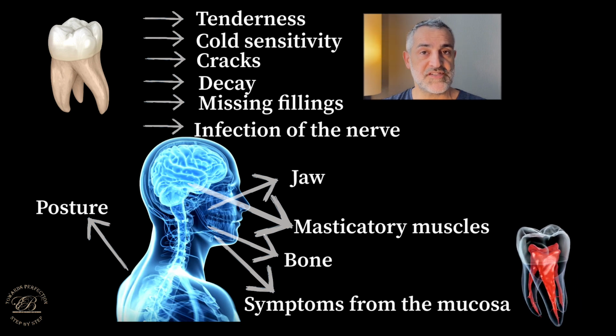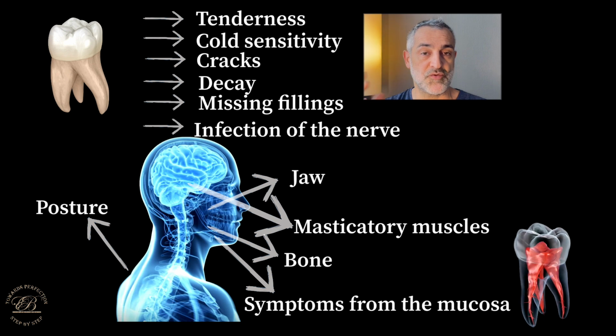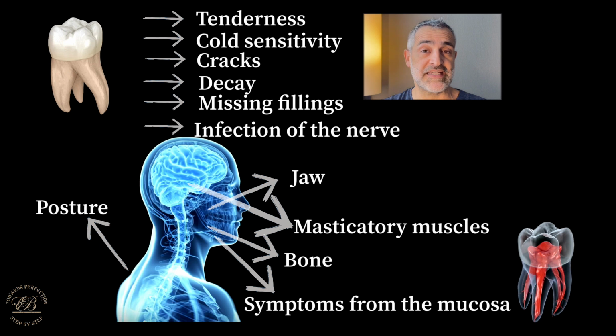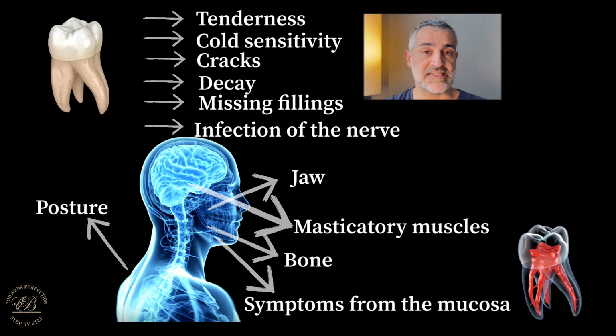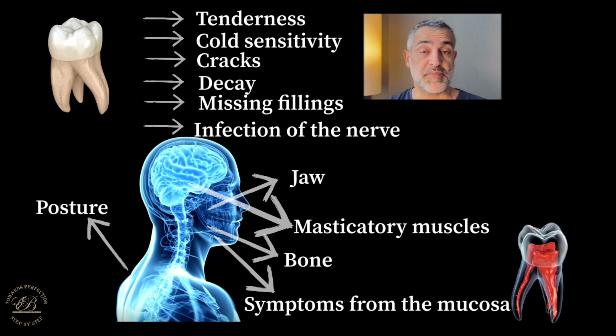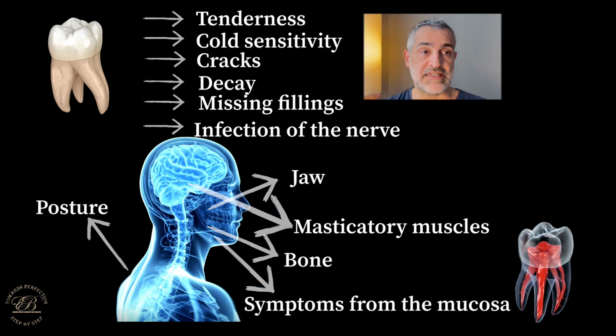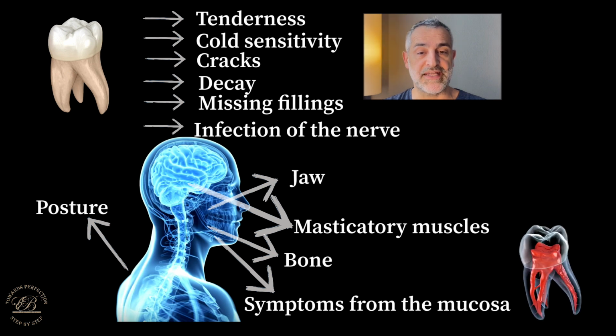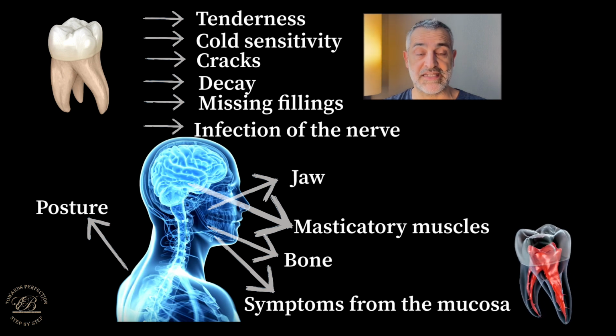Now, I only have 10 minutes, so I will not be able to do a full presentation of everything. So I'm actually just taking the last presentation I did, which was DTR treatment. That means it's treatment where you try to minimize the time frame from when the patient occludes until they have their canine guidance. So DTR stands for disclusion time reduction, and that's the whole point. And this guy came in for exactly that.